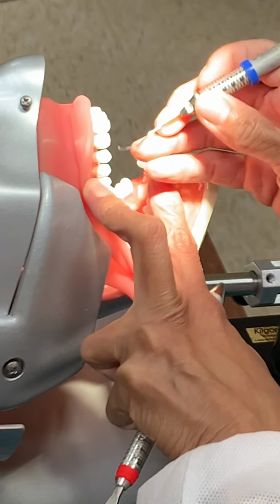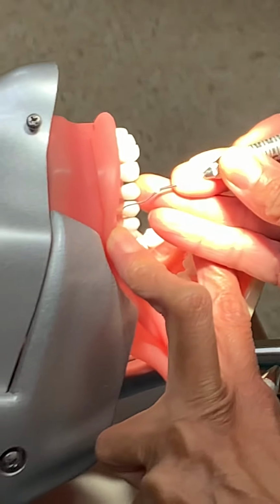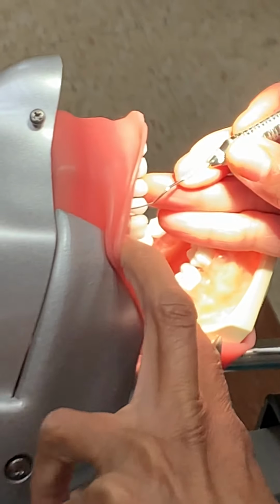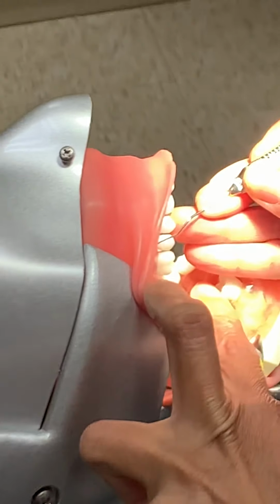So maxillary, I'm going to start at the distal line angle. And my hands look kind of a little crazy because I'm trying to hold this up. Distal line angle. And you see my wrist, I'm still using my wrist motion. And come distal line angle, and then come mesial.